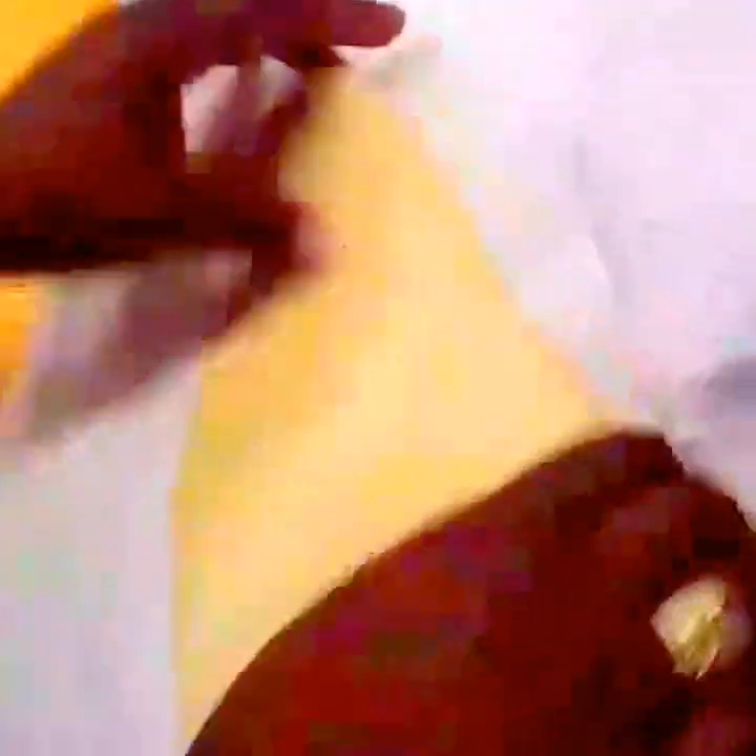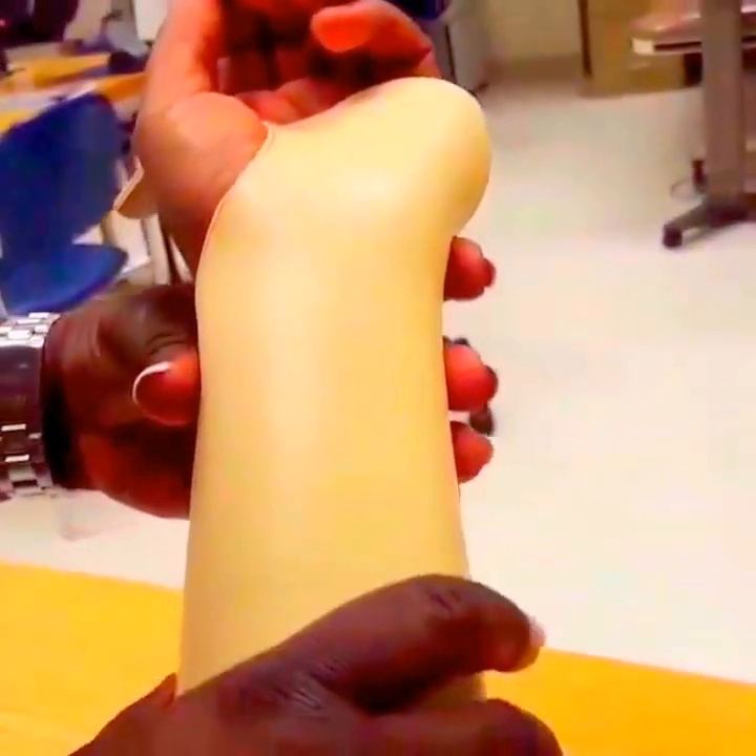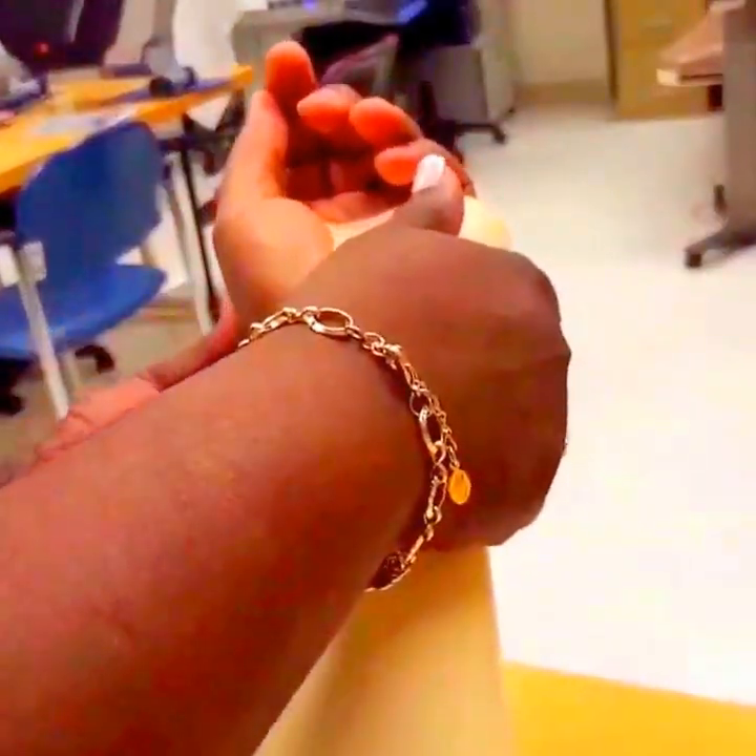Make sure you remove the excess water and check to make sure it's not too warm before you apply it to your patient. Use the arm elevator to help support the wrist and have the patient position their wrist in a manner to maximize the benefits of gravity. You want to gently use broad strokes on the trough to minimize pressure marks. You can have the patient make the okay sign to make sure that the splint will rest when the hand is in a functional position.